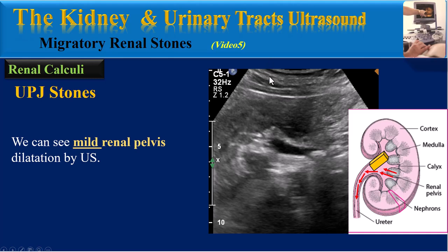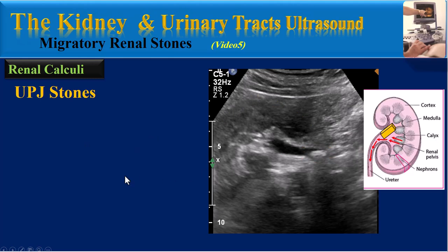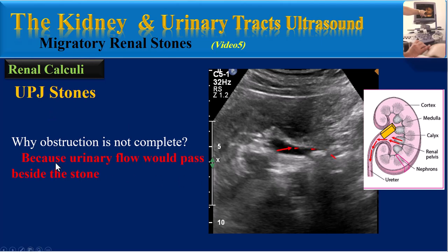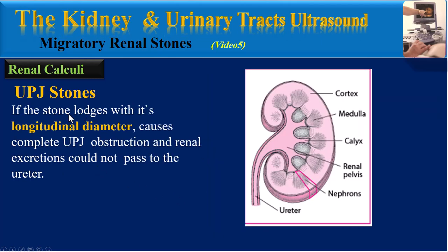When the patient presents for ultrasound, we can see mild renal pelvis dilatation. In this trans-abdominal ultrasound image from the kidney, we can see the UPJ stone, the renal cortex, and the renal pelvis with mild dilatation. The obstruction is not complete because urinary flow would pass beside the stone into the ureter, as you can see here.